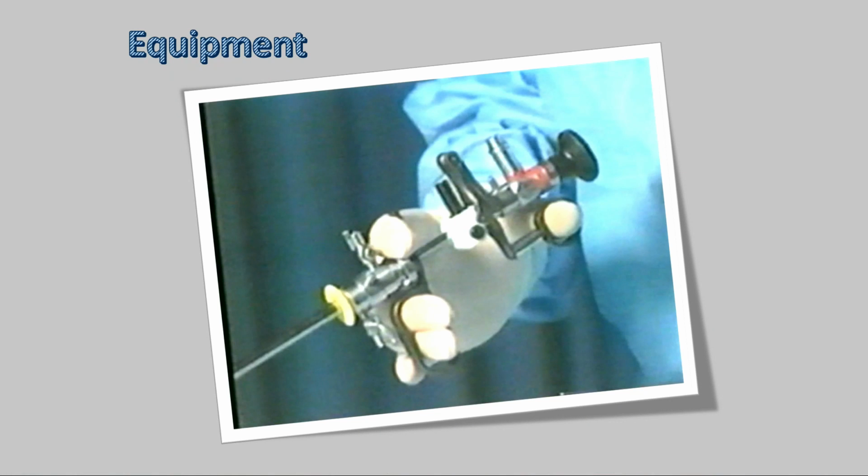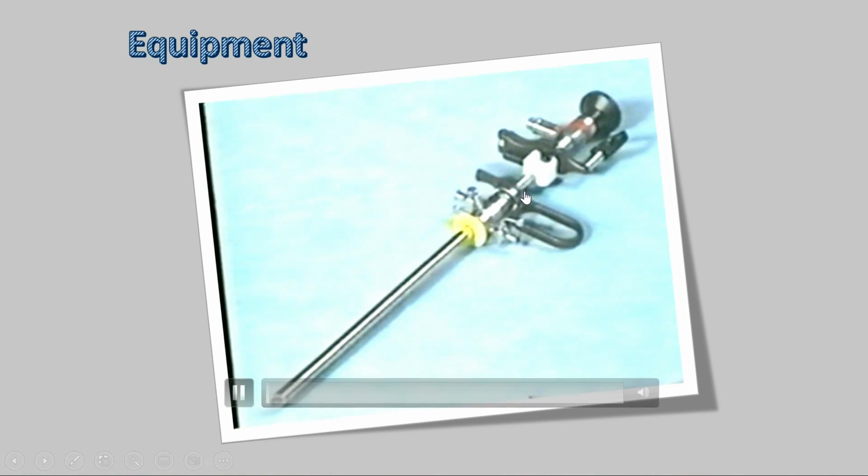But that is only required if you have a pathology which needs current. Like Asherman, you don't need a resectoscope. I can cut with the scissors. But if you have a submucous myoma, I need a resectoscope. So all these channels you have to buy together. Every channel has its own importance. If I have to do only diagnostic, why should I put the 4 channel? Unnecessarily why should I overdilate? So this is important. And now lastly this resectoscope. Access, and here you will see many people do it by naked eye, many people do it by camera.